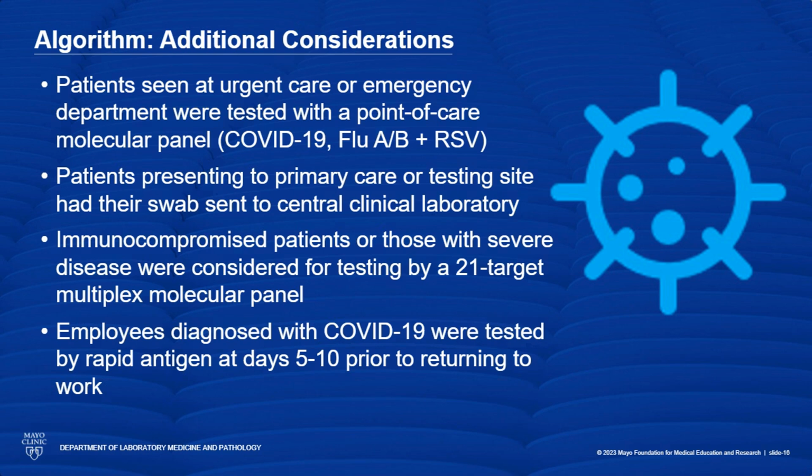And we did this because, one, we wanted to know how long do individuals stay antigen positive after they're diagnosed? And 2, given the shortages of the workforce during the heart of the pandemic, was there a way that we could use antigen testing as one component to allow some of our staff to come back to work if they didn't have symptoms?